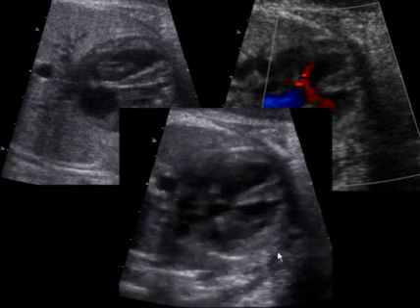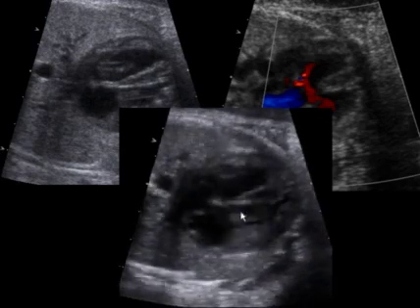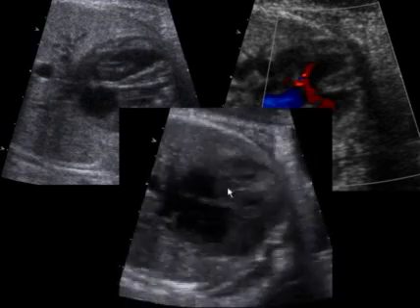And once we know it's there, we can angle the probe to see the VSD right here.